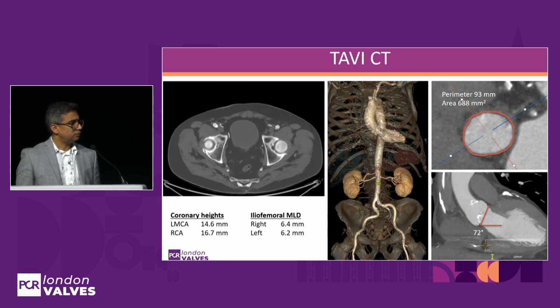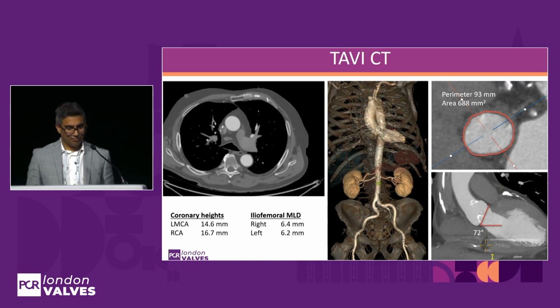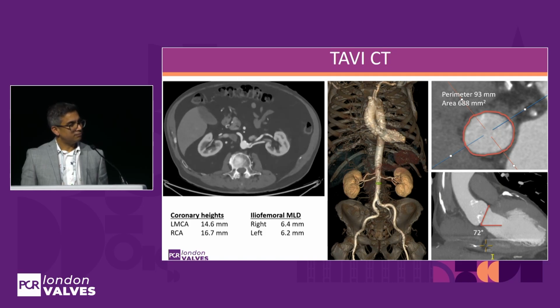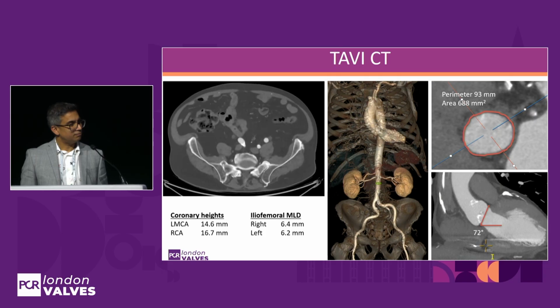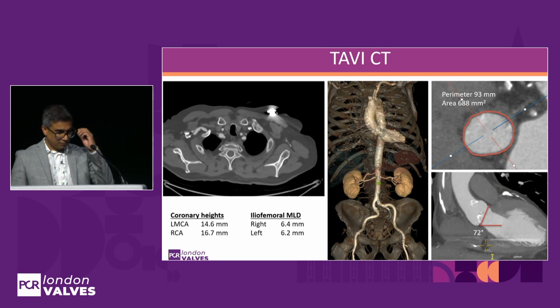Thanks, Maurizio. This is kind of an Australian case, isn't it, Virag? Big gentleman, big annulus, and he does have comorbidity with some left ventricular dysfunction as well. Nothing really precludes most of the available TAVI devices. In our centre, we would be looking at either a balloon expandable or a self-expanding valve. There are a couple of interesting aspects. First, if I was doing a balloon expandable, we would be doing an overfill. The second thing is the horizontality.